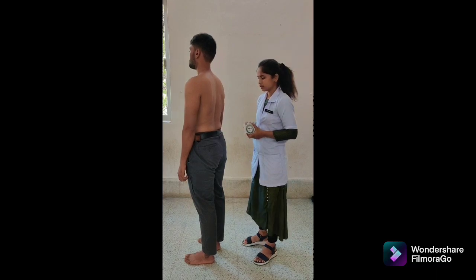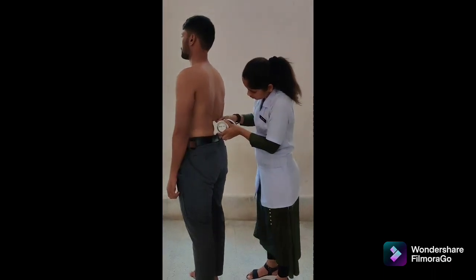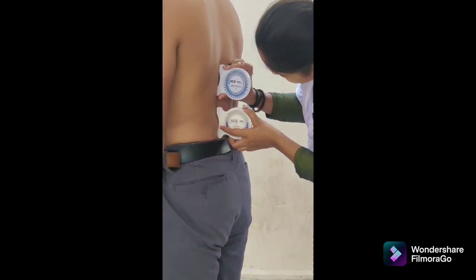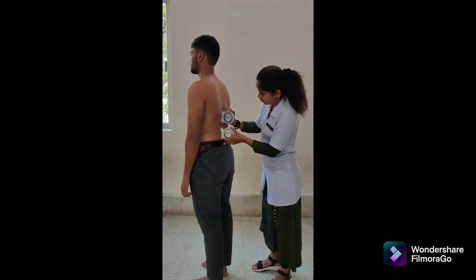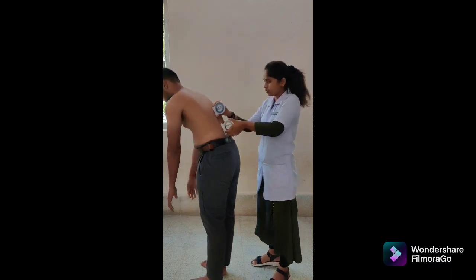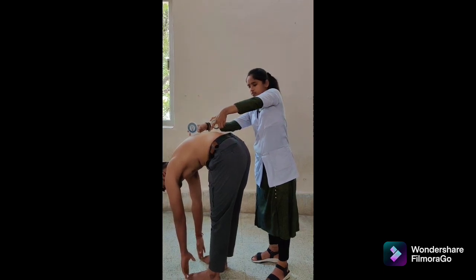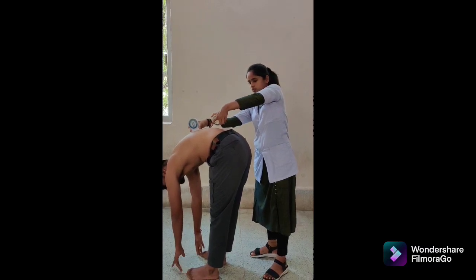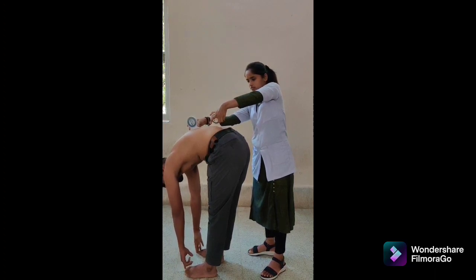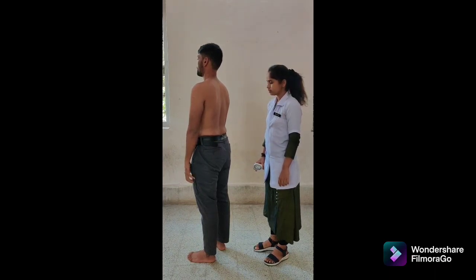Second method for lumbar flexion is double inclinometer. Patient position: standing. Inclinometer alignment: place one inclinometer over the spinous process of T12 and the second over S2. Both adjusted to 0 degrees. Instruction: bend forward as far as possible while keeping the knees straight. Maintain the inclinometers against the spine during the motion. Note the degrees indicated by the inclinometers. The difference between measurements at T12 and S2 is the lumbar flexion range of motion.